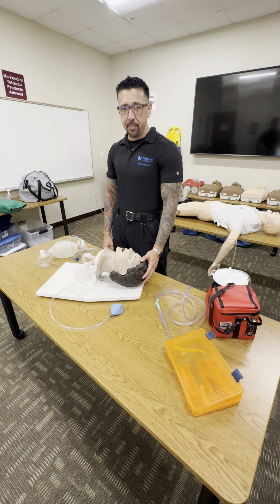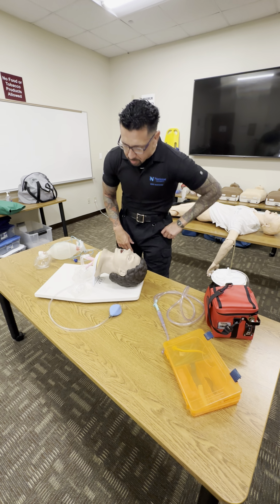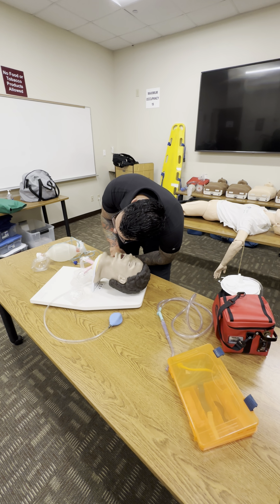BSI, scene safe? It is. Ma'am, are you okay? I got nothing. Call 911, get an AED. I'm checking for breathing and pulse simultaneously, no less than 5 seconds, no more than 10. 1,000 1, 1,000 2, 1,000 3, 1,000 4, 1,000 5.